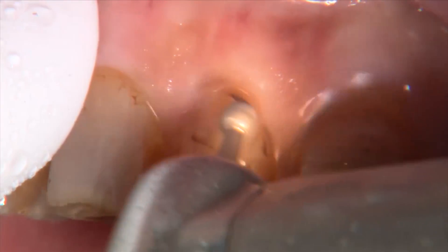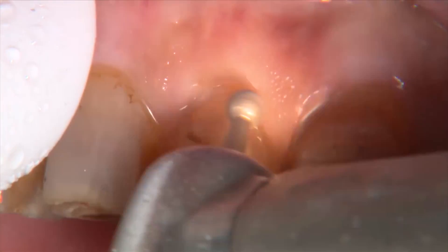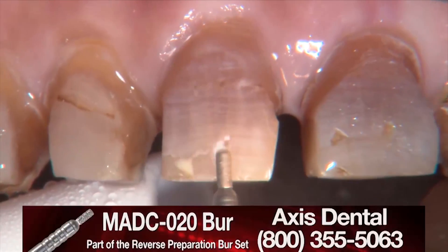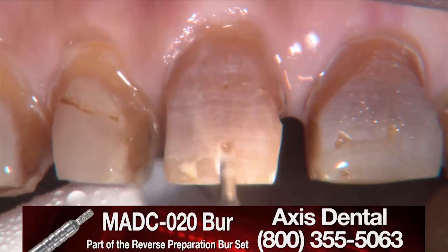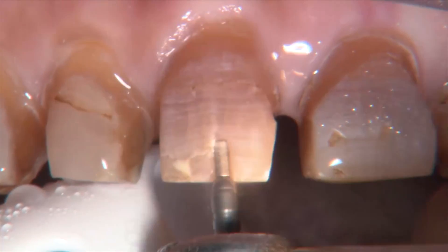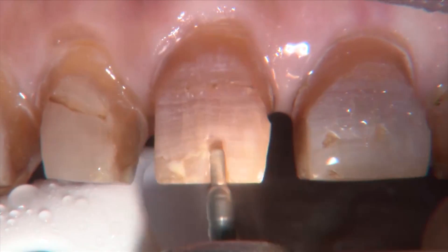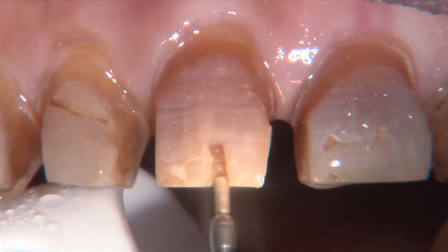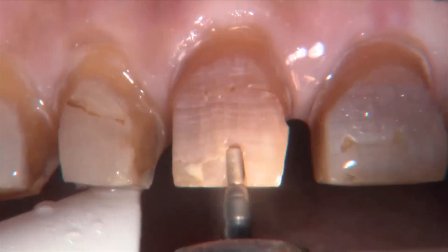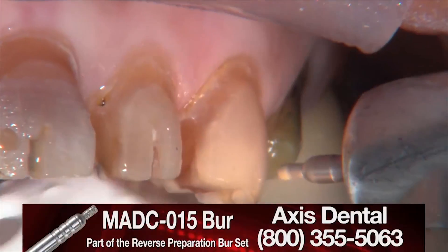This is the 801-021 bur being used on all the teeth we're preparing, just tracing it around at the gingival margin. Usually we'd pack a cord at this point, but I'm not sure we're going to impress this case today. We do end up impressing it, so I decide to try a different way — instead of a two-cord technique, I'm going to end up putting a double-zero cord in, dropping the margin if I have to, and then using a cordless approach with the new retraction capsule from 3M ESPE on top of that.